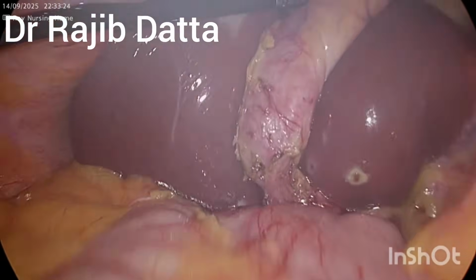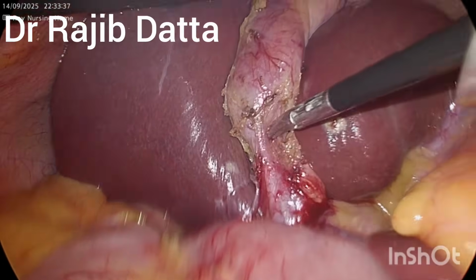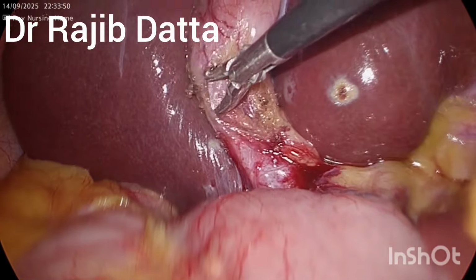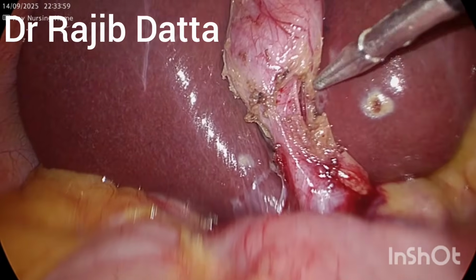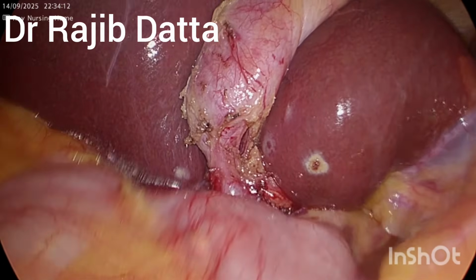Now we are just trying to separate the cystic artery and the cystic duct. For this, the Maryland forceps has been introduced to make room in between the cystic artery and the cystic duct. Small separation here is going on for proper visualization.